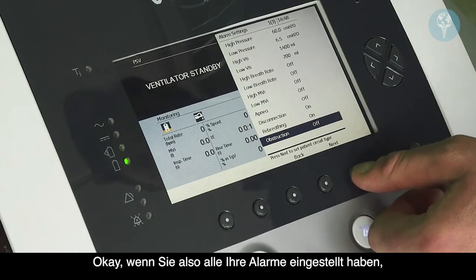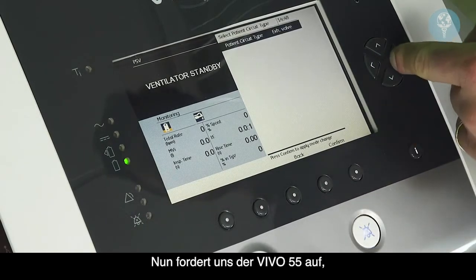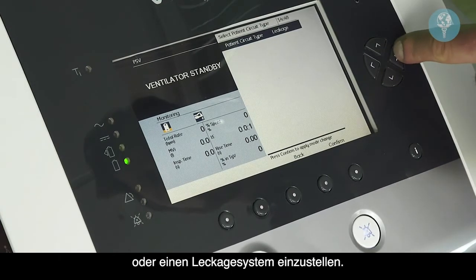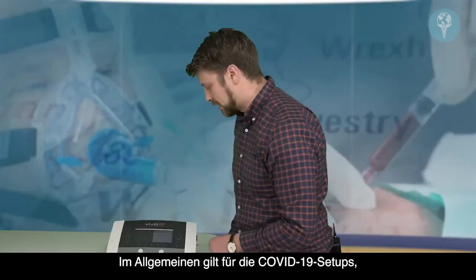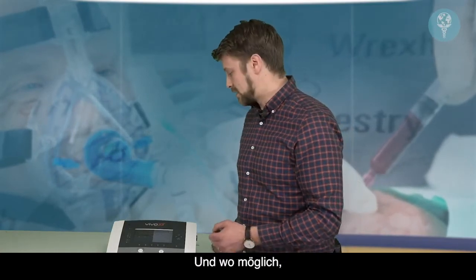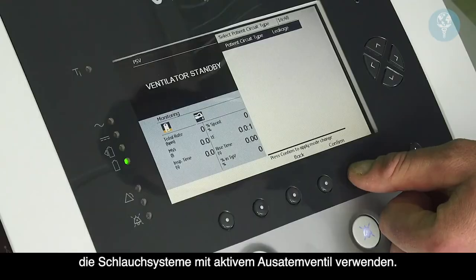Okay, so once you have set all of your alarms, we press the next button at the bottom, and now the Vivo 55 asks us to set either an exhalation valve circuit or a leakage circuit, as you can see there. Generally for these COVID-19 setups, the non-invasive circuits that we'll be using will be the leakage circuits, and where possible the invasively ventilated patients will be using the active exhalation valve circuits.